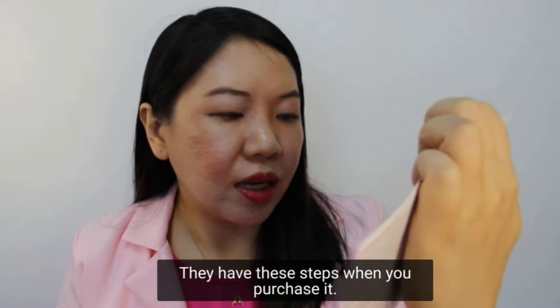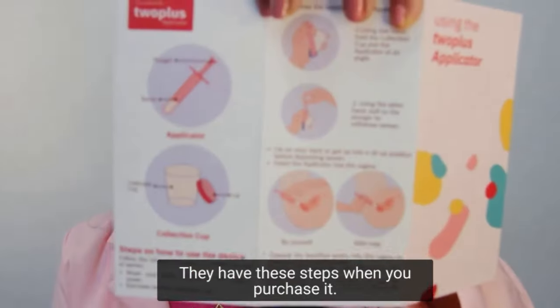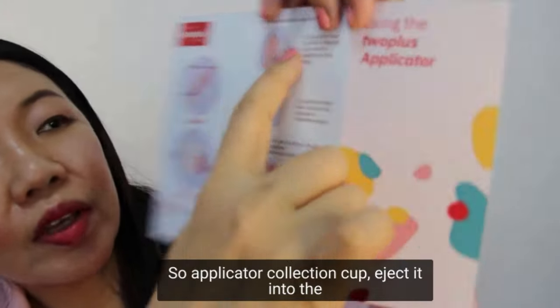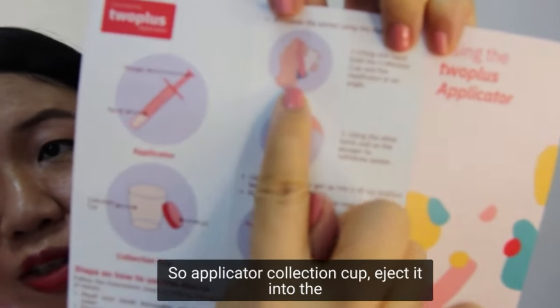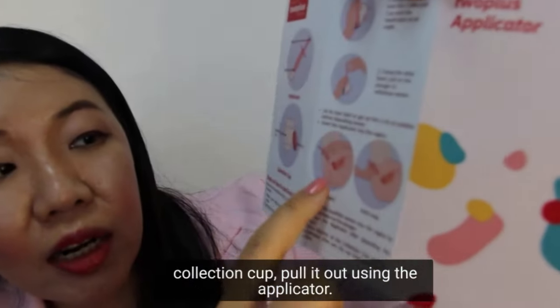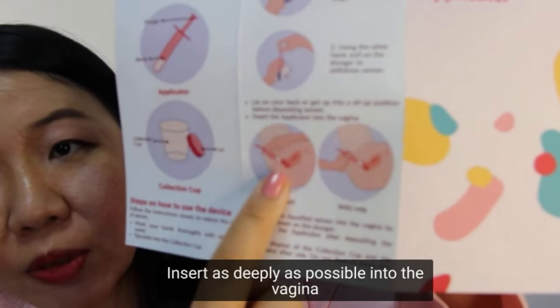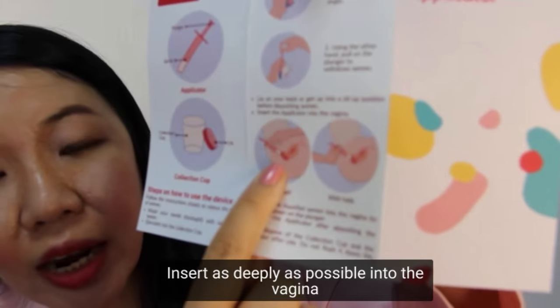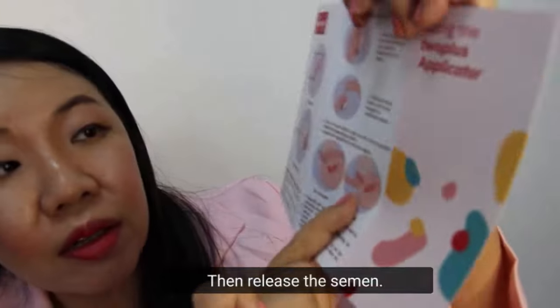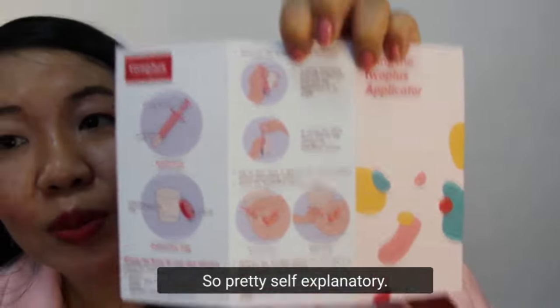They have these steps when you purchase it: applicator, collection cup — ejaculate into the collection cup, pull it up using the applicator, insert as deeply as possible into the vagina, as close to the cervix as possible, then release the semen. Pretty self-explanatory.